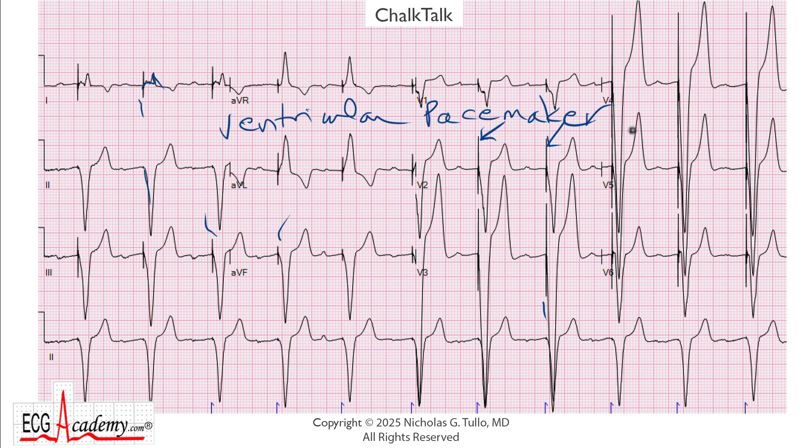Unfortunately, a lot of times ECG readers will look at this and just call it a ventricular pace rhythm, and then they'll go on to the next tracing. But anytime you see a ventricular pacemaker, you have to ask two questions: Is it a single or a dual chamber pacemaker, and what are the atria doing?